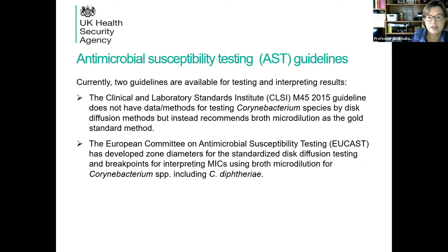There's the CLSI guideline, but it doesn't have any data or methods for testing Corynebacterium species by disk diffusion. Instead, it recommends the broth microdilution method as the gold standard. EUCAST has developed zone size diameters for disk diffusion testing and also breakpoints for interpreting MICs using, again, either broth microdilution for Corynebacterium species, including C. diphtheriae.